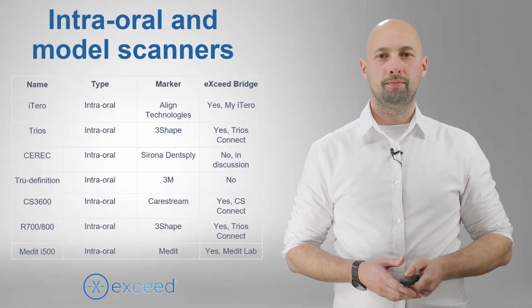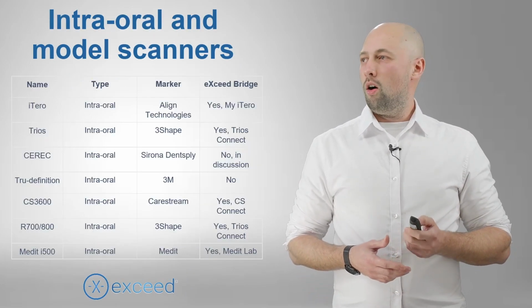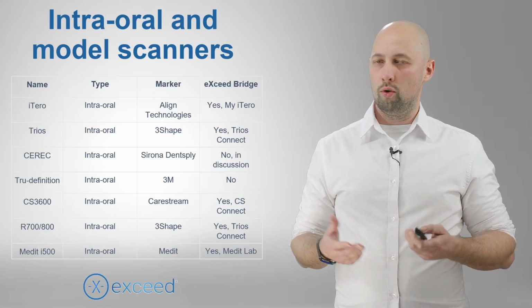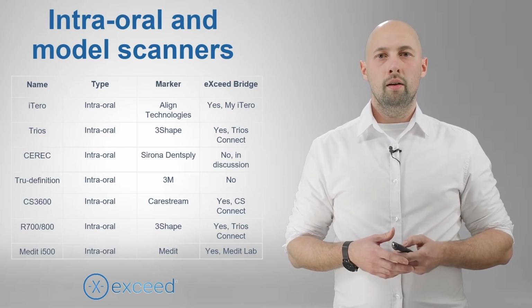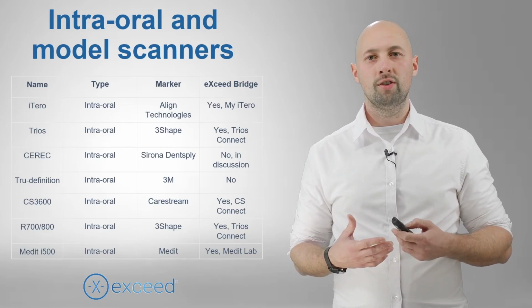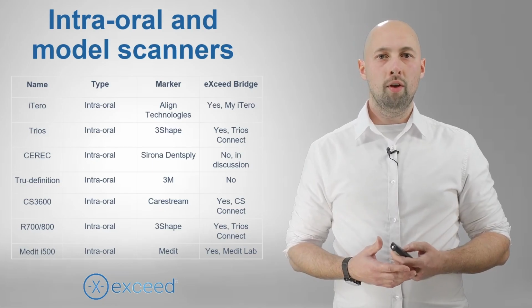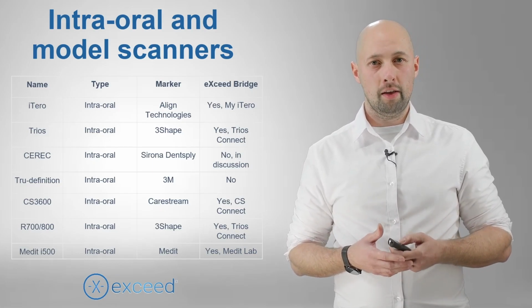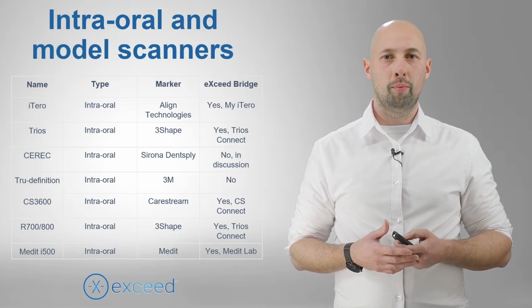Intra-oral scanners. On the slide, you can see the list of the intra-oral scanners. They are needed for creating accurate digital impressions of your patient's teeth. You have the options of using either an intra-oral scanner or traditional silicone dental impressions.